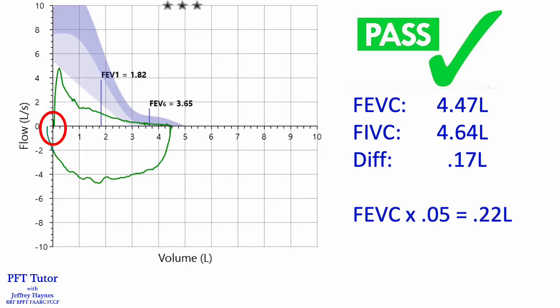Here's a real-life example. The forced expiratory vital capacity is 4.47 liters, and the forced inspiratory vital capacity is 4.64 liters, a difference of 170 mLs. But because 5% of the vital capacity is 220 mLs, the 170 mL gap is considered acceptable.